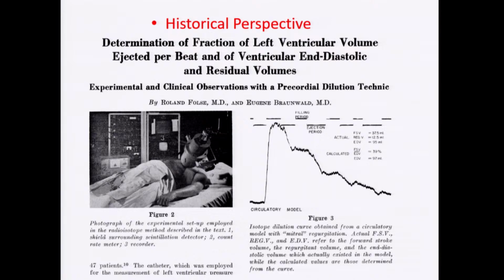It's a dilution technique. Essentially, you inject a radioisotope and capture it with a camera that you can see there. Anyway, so this is from a historic perspective of why we come back.